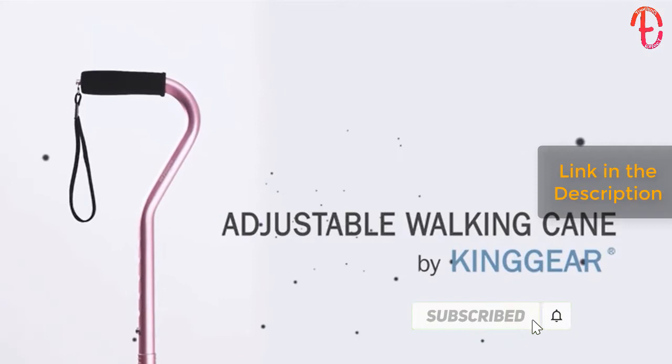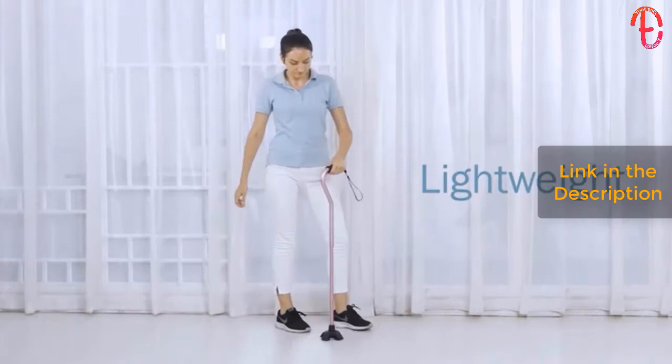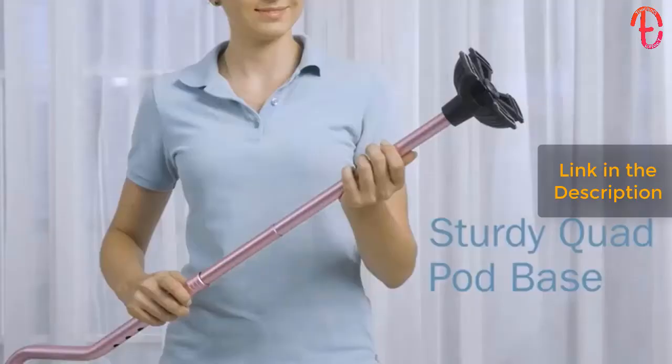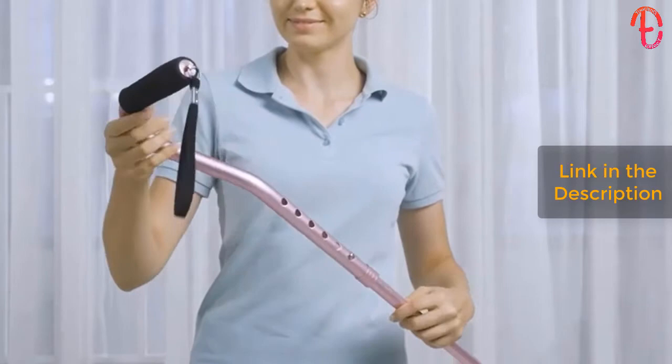We want to introduce a lightweight heavy-duty walking cane at 1.7 pounds. It's very convenient to carry and comes in a variety of gorgeous colors. The non-skid industrial grade rubber base provides optimized traction for any terrain.